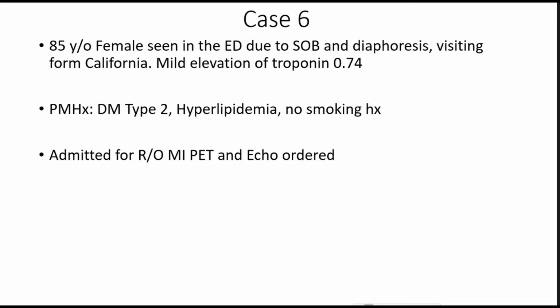So the differential here, it could be amyloidosis or infiltrative disease. And so that is almost the complete negative of what you'd expect with amyloidosis, where you'd have apical sparing. So strain really helps with sussing out the differential in this case, whether or not the tissue at the apex is abnormal versus normal.